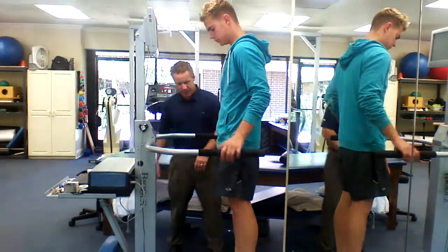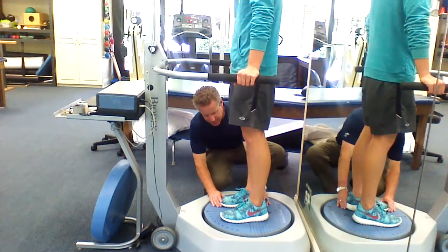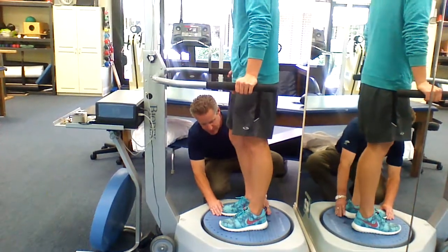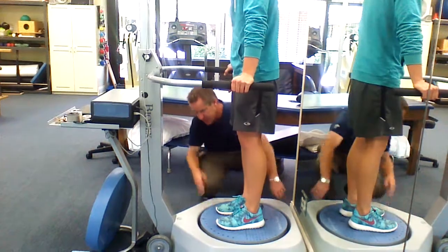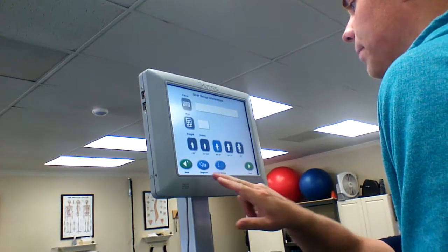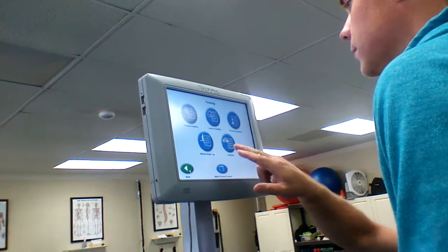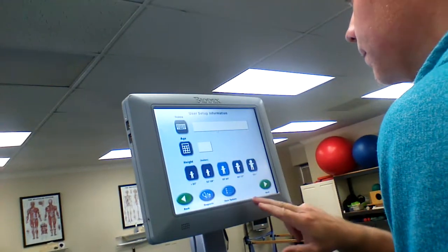Luke, go ahead and put your hands up there. I'm going to make sure you're in the right spot. It actually looks like you are right there. Move that one just right there. And then we're going to come over here, turn the machine on, and we're going to exit out of this. We're in testing mode, so that's convenient. Limits of stability there.